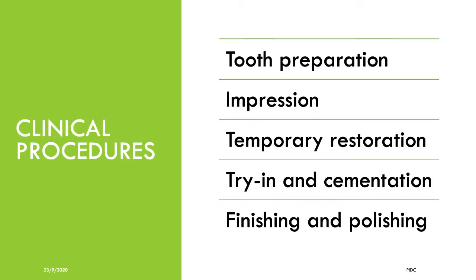So clinical procedures. That involves two steps, that is first sitting and second sitting. The first sitting involves tooth preparation, impression and temporization of the restoration. The second sitting involves trying, cementation, finishing and polishing.